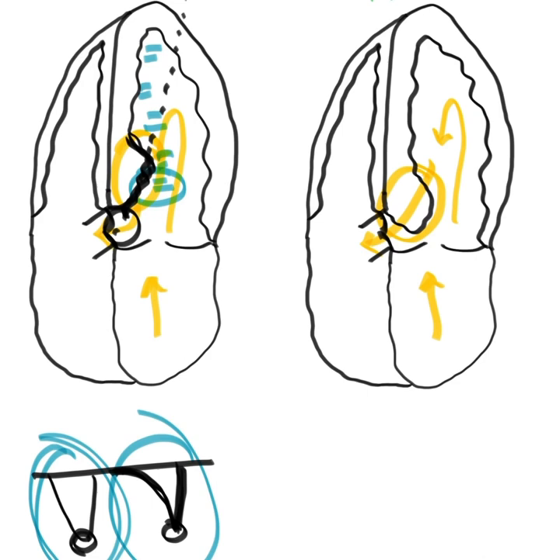And lastly, once you find the location with pulse wave, you'll do the same thing. You'll pulse in that specific area, but then you're going to have your patient Valsalva. And what do we know Valsalva does for our patient? Valsalva is going to increase right-sided pressures. It's going to decrease your venous return.